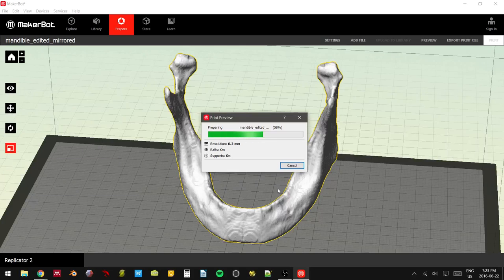So typically 99.999% of our 3D printing is done with either a TAZ 5, and we're eagerly awaiting the 6s to be sold here in Canada. We currently run 3 of those in 3 different configurations. One has a dual nozzle setup, one has a flexible nozzle doing NinjaFlex almost 24/7.